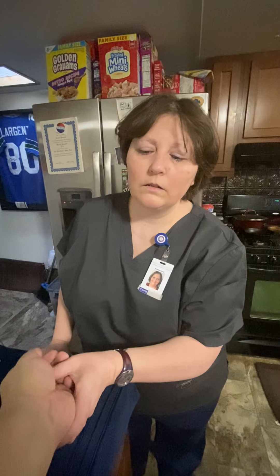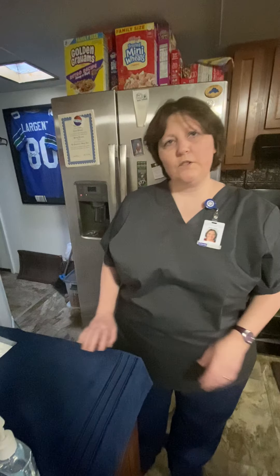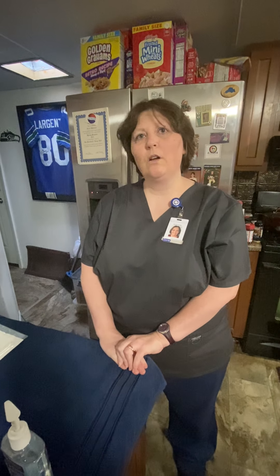Knock knock knock. Come in. Hi Mr. Peterson, my name is Corey and I'm going to be your student nurse today. Can you tell me your name and birthday? Kevin Peterson, 9/3/76. Okay, perfect. So your doctor has ordered an IV catheter to be inserted so that we can put some fluids in. Have you ever had an IV before? Several. Okay, good.